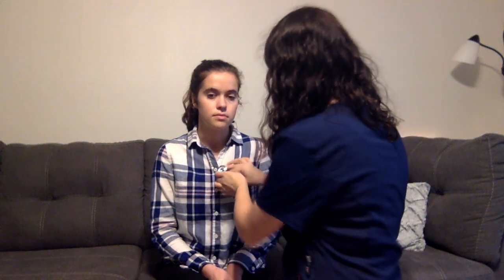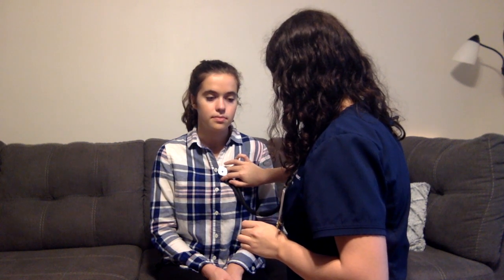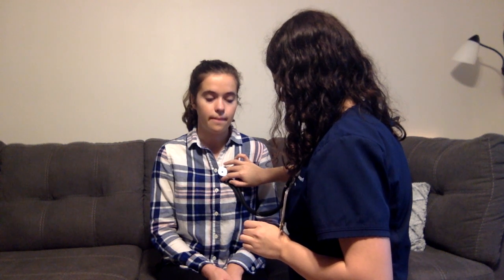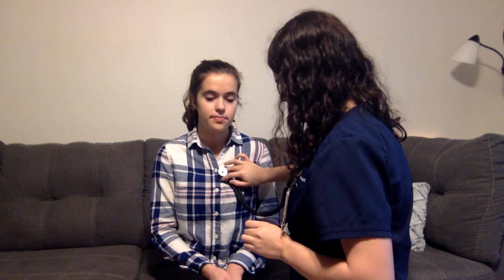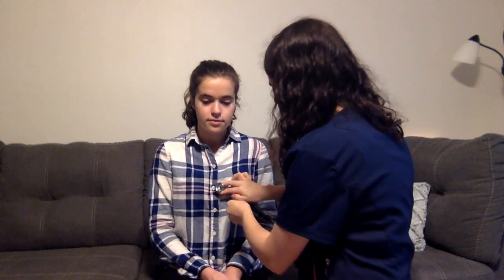The second one we're going to listen to is the pulmonic valve, and you find that on the second intercostal space as well, but on the right left side of the sternal border. Next, on the third intercostal space, we are going to listen to Erb's point, which is also where you will hear your point of maximum impulse.